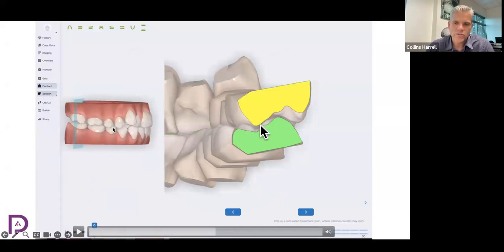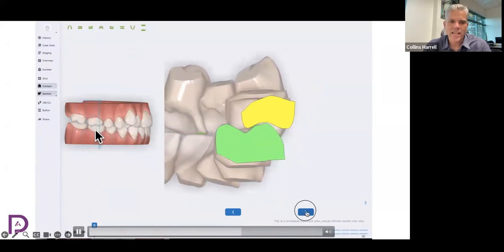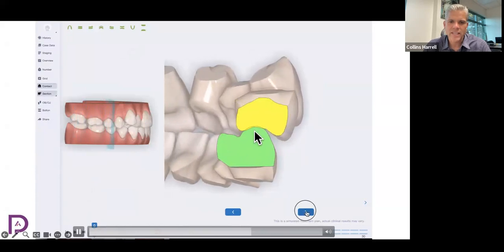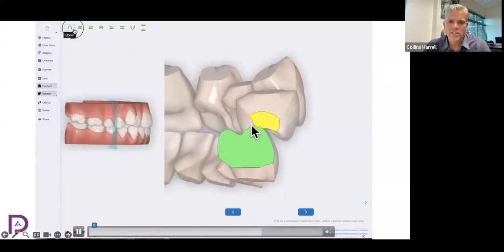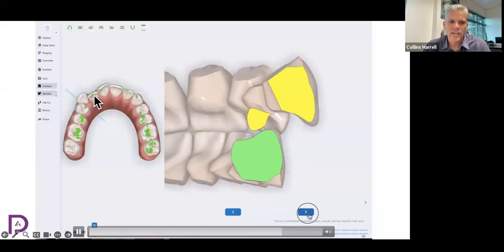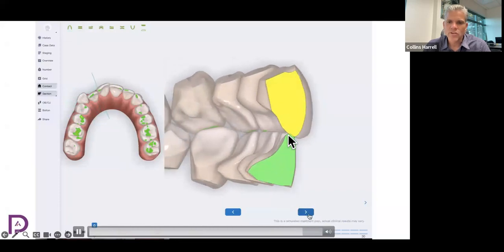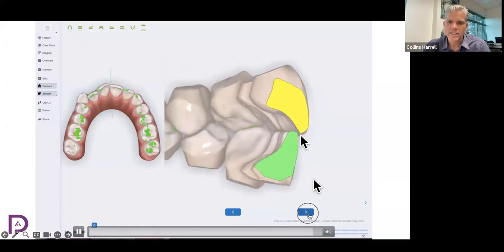And then it shows you the actual occlusion, because it's hard to tell in a model, like how do these teeth, if I could look inside the occlusion, how are they actually hitting? And so you can run through by clicking on this little arrow, you can see how the little slider drags to different parts of the teeth, and then you can watch the occlusion change here. So see how this slider is going through the teeth, and when you hit contact points, you can see the contacts. And where there's no contact, you can see that there's no contact.